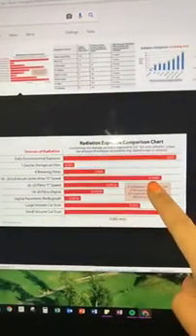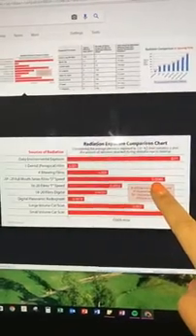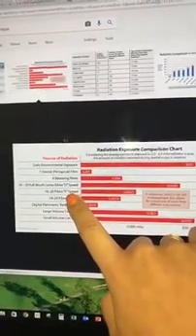And even the 18 to 20 x-rays of the full mouth series is still not quite as much as you get from just walking outside. It's still less than that 0.01. One other thing that's interesting here is you have to compare this D speed and this F speed. That's referring to film x-rays, where they have to be developed. You need more power in order to develop those kinds of x-rays. Here at Horizon Dental, we have digital sensors, and our panoramic x-ray machine is all digital, and that reduces the amount of radiation.